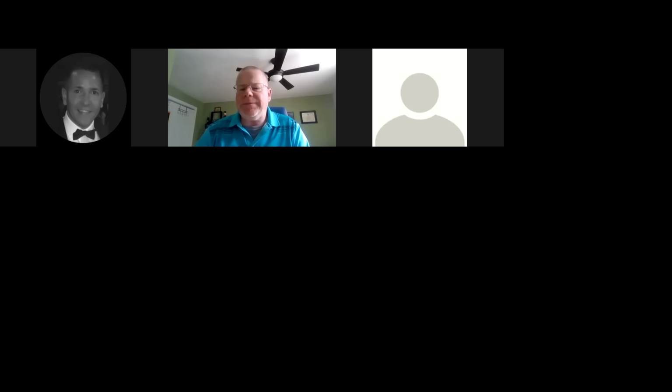It is a little bit more difficult to get good T1 contrast because you've got a narrower window to get that contrast. Okay, hold on. All right, so let me answer Jane's first. So, you've got a narrower window of opportunity for T1. You've got a narrow window for TR, and you have to keep a short TE. If you start getting too generous, you lose T1 contrast.